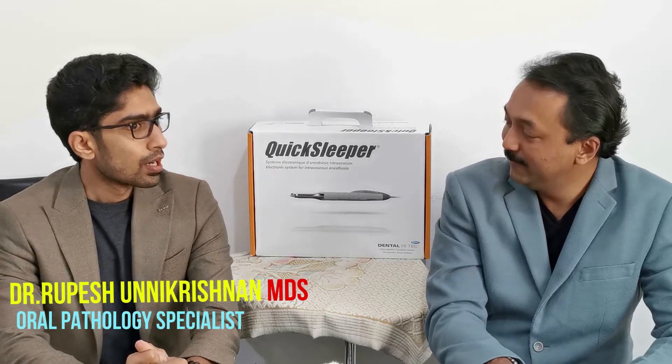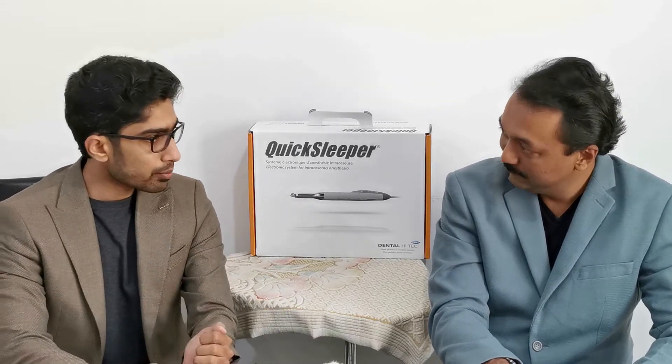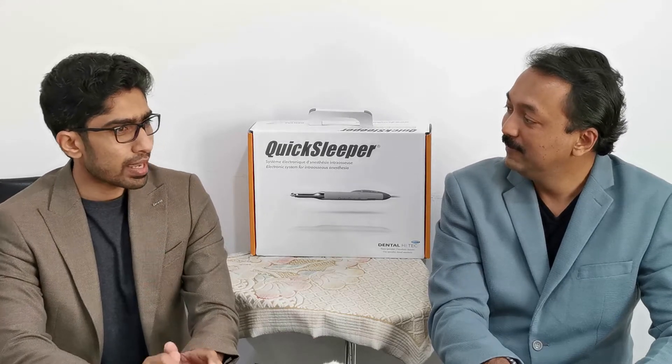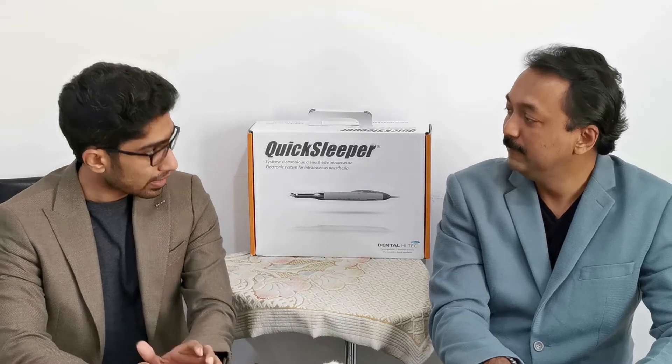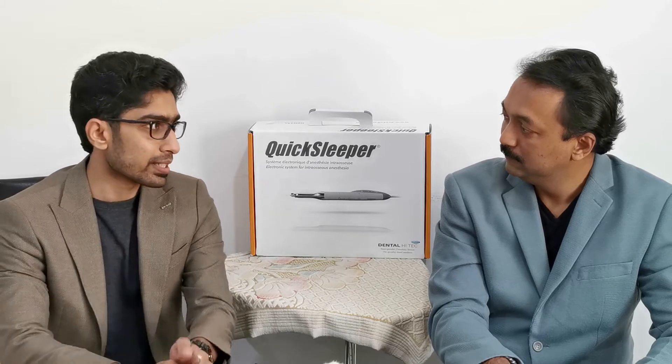Okay, what all do we need for that? From the previous video, whatever components were inside the box — those are the major things required — but we do require two things externally. Number one is a power source through which we can connect the device, and the second one is the anesthetic carpule that we need to place in the device.